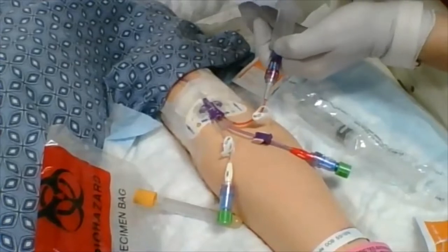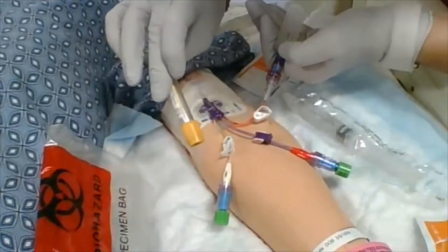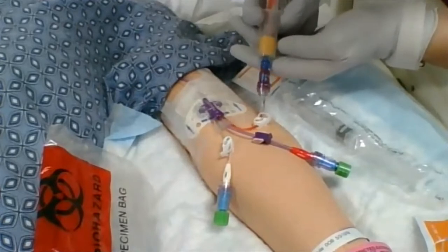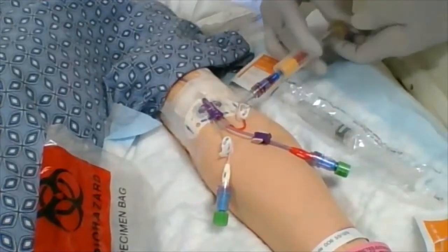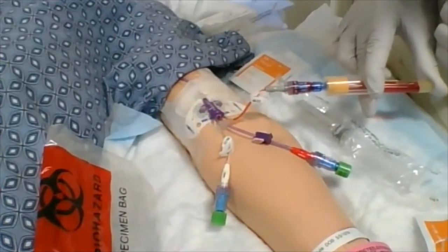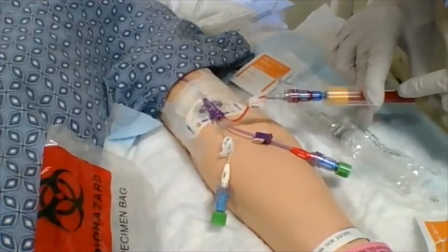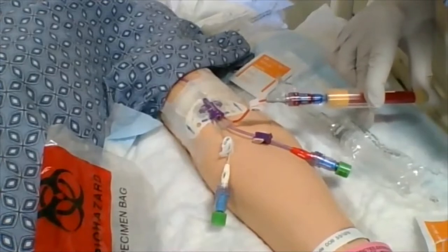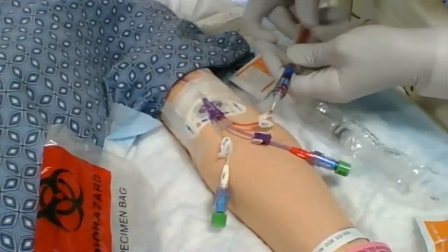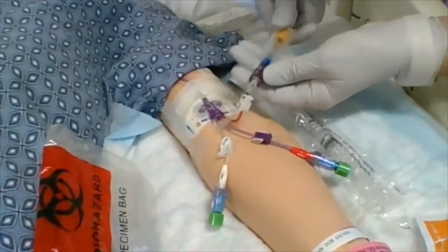I have nice good blood in here. I'm going to take the tube I need — I'm getting some electrolytes today. I'll go ahead and engage the tube into the needle itself, and as you can see, I'm getting some good blood return. The natural suction or vacuum inside this tube will pull out the blood until it's satisfied. If I had any other tubes to draw, I could draw them now, but I don't. So I'm going to take this out and clamp.